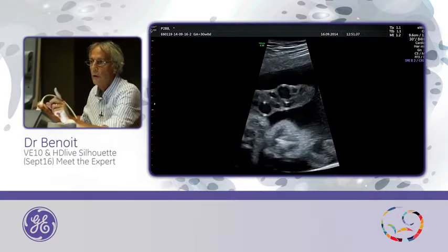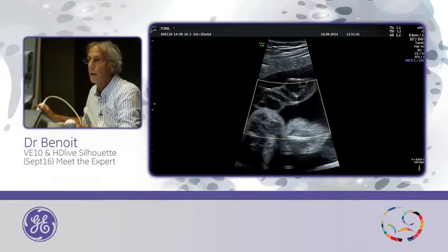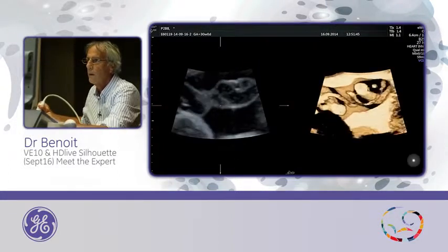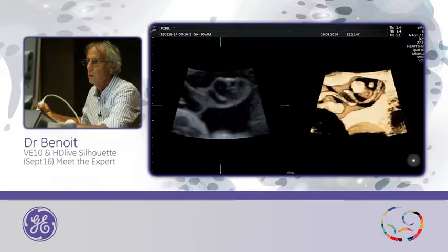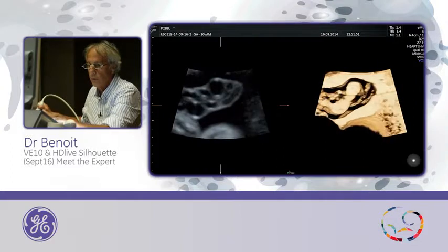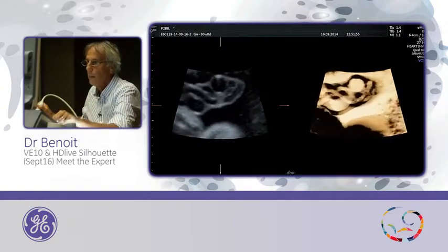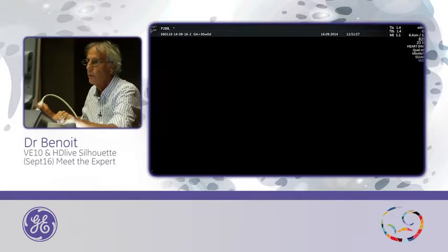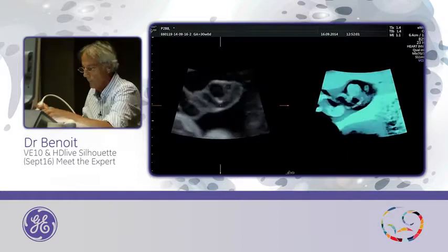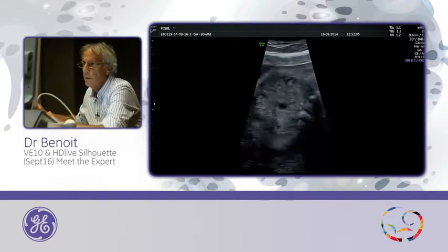with liquid. Look at this umbilical cord. I will do it on the umbilical cord. Okay, I start. And this is a view of the cord with one vein and two arteries. And we can change transparency. I increase the thickness. And I can switch to the blue. Okay. I will do it here.